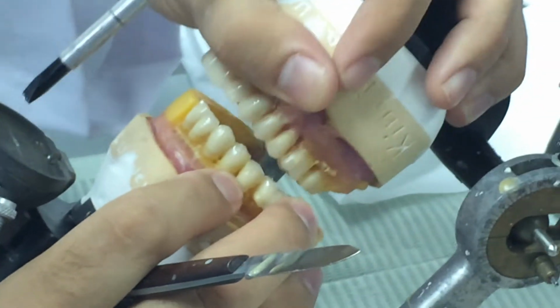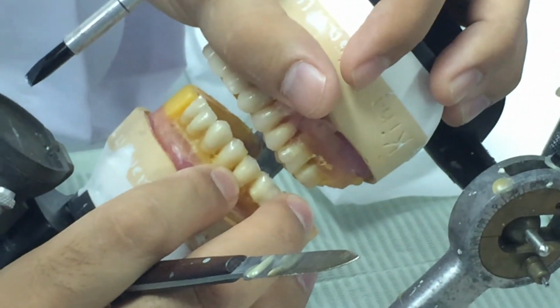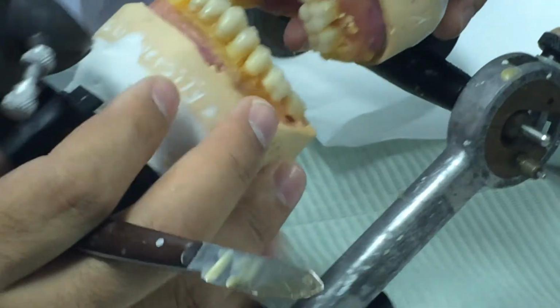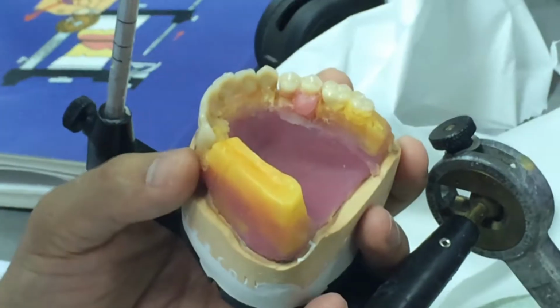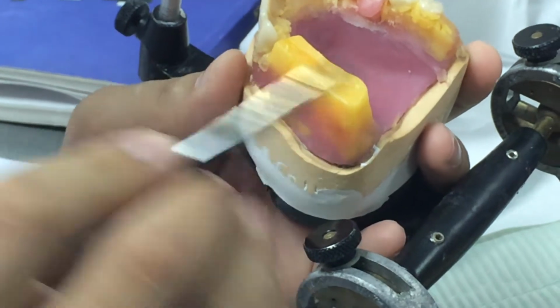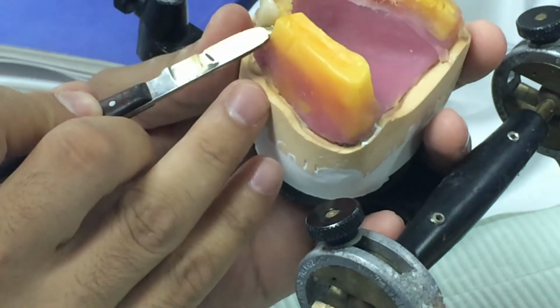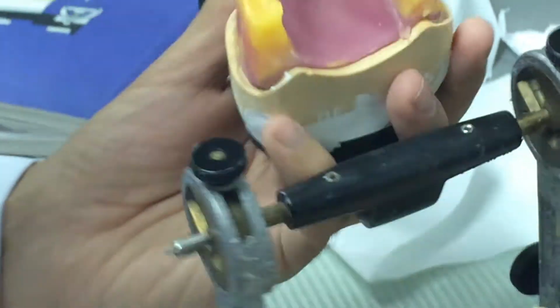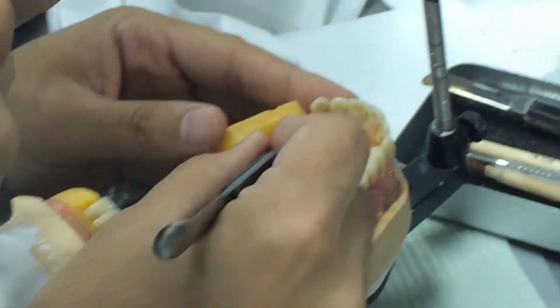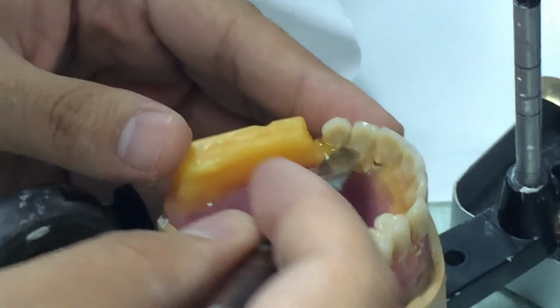We have to do a trimming for the record block or record base. فاهمين؟ I start doing a trimming for the record base, then I'll get enough space, because the thickness of the record base is almost 2 millimeters. صح ولا لا؟ So I'll take advantage of this, then I'll start trimming the record base, and then there will be a space for me.